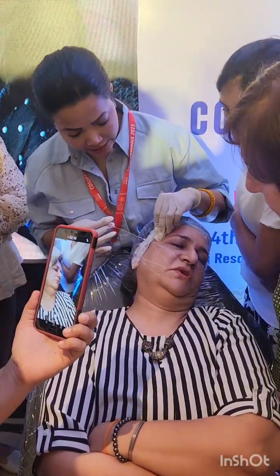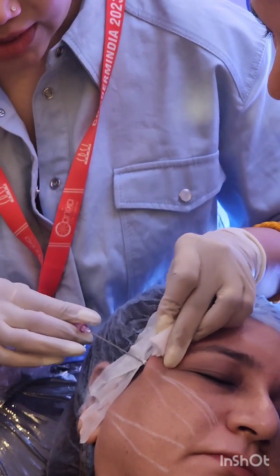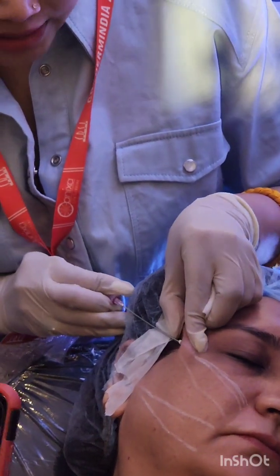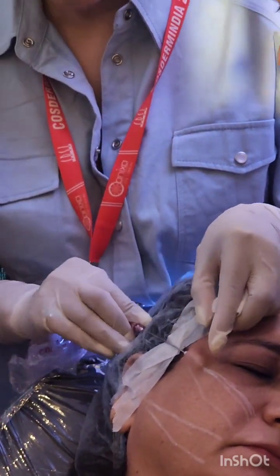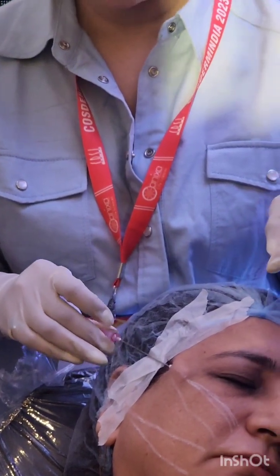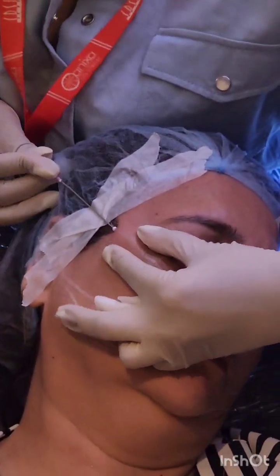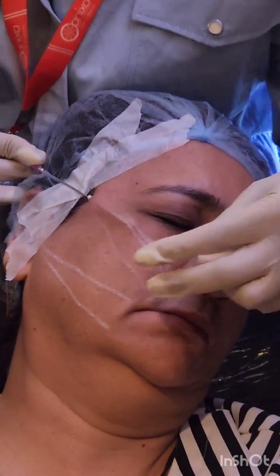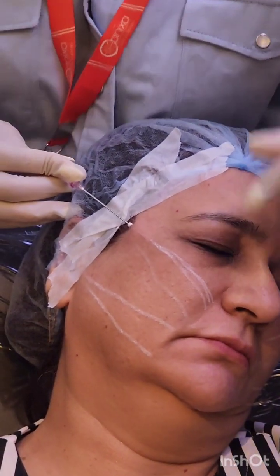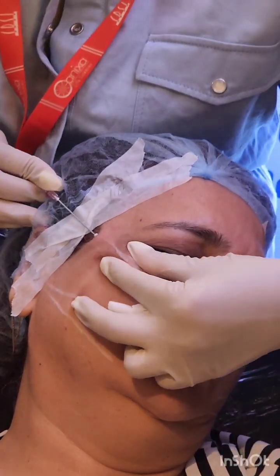Ma'am, can we start? You'll feel a little traction. Don't worry. So this is a pinching technique. That is how you know that you are in the subcutaneous plane. Always keep your needle parallel, and I'm lifting it. What does it signify? That I'm in the right plane, and you can see the patient is not wincing. That is also a sign that I'm in the right plane. I'm trying to lift it. She will start wincing the moment I'm near this area. Okay? So right now she's comfortable.